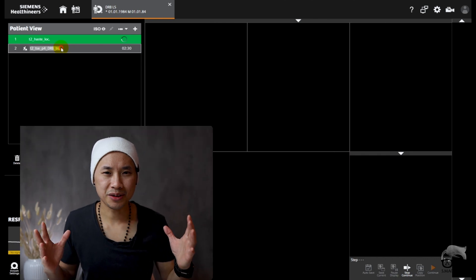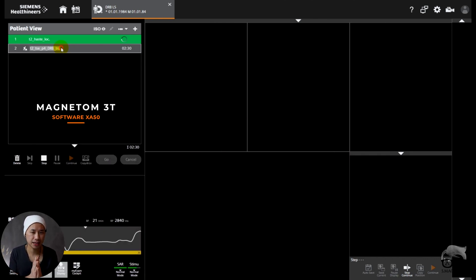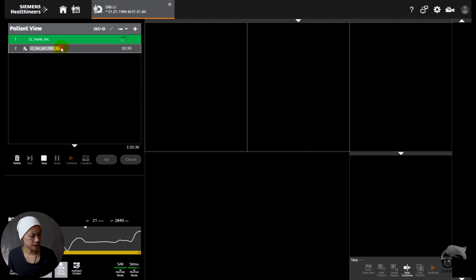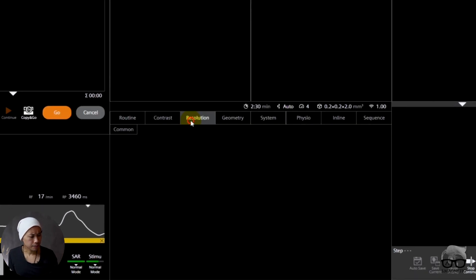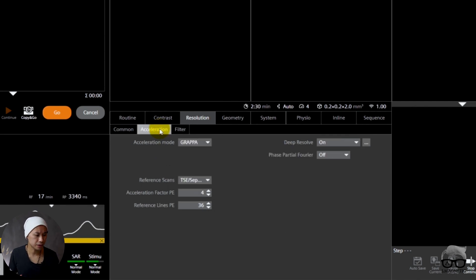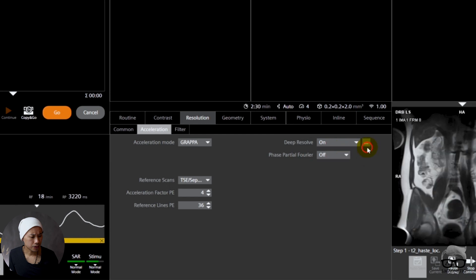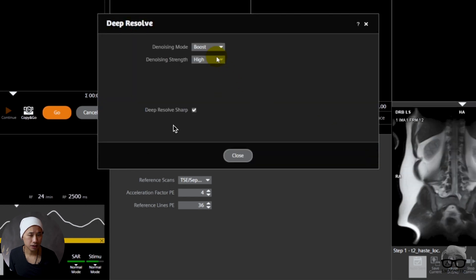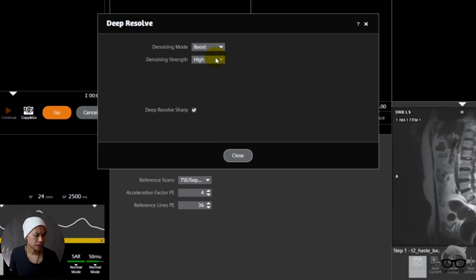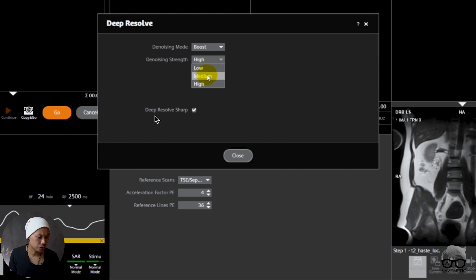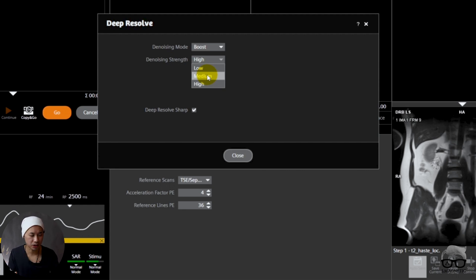We are currently at the Magnetom 3T using the software XA50. I'm going to apply Deep Resolve Boost, which is Siemens' name for their deep learning. We're going to do a lumbar spine scan — just transversals from a single scan — and from that single scan I'm going to create multiple images for comparison. People ask where you can find Deep Resolve Boost: right here under Resolution Acceleration. You can toggle it on or off, go to Boost, and then choose between high, medium, or low denoising strength. You can also turn off Deep Resolve Sharp — there are tons of possibilities, not just on or off.